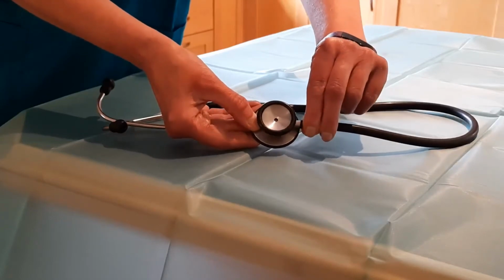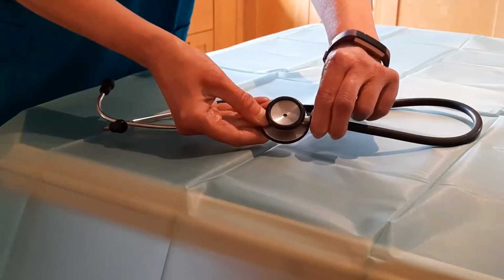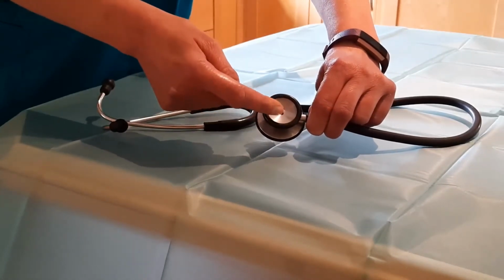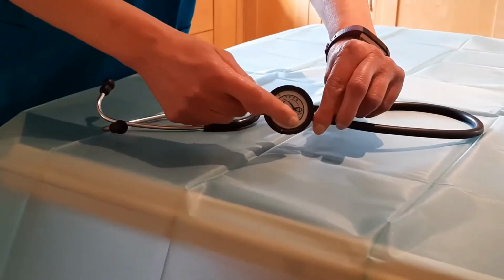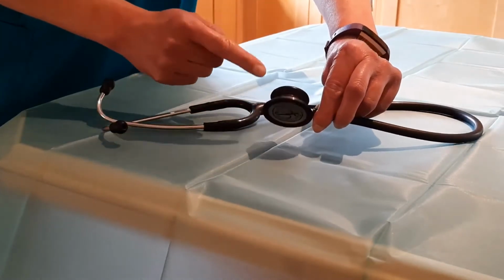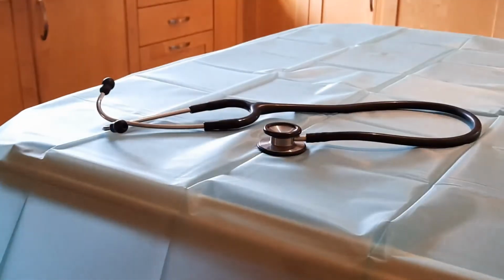There's a small hole here in the centre, and when you twist the chest piece, it opens up. And that means that sound will now travel from this side, the bell. Twist it again, and it closes. And sound will now travel from the diaphragm. So it's important to make sure that this is correctly set up before you auscultate your patient.